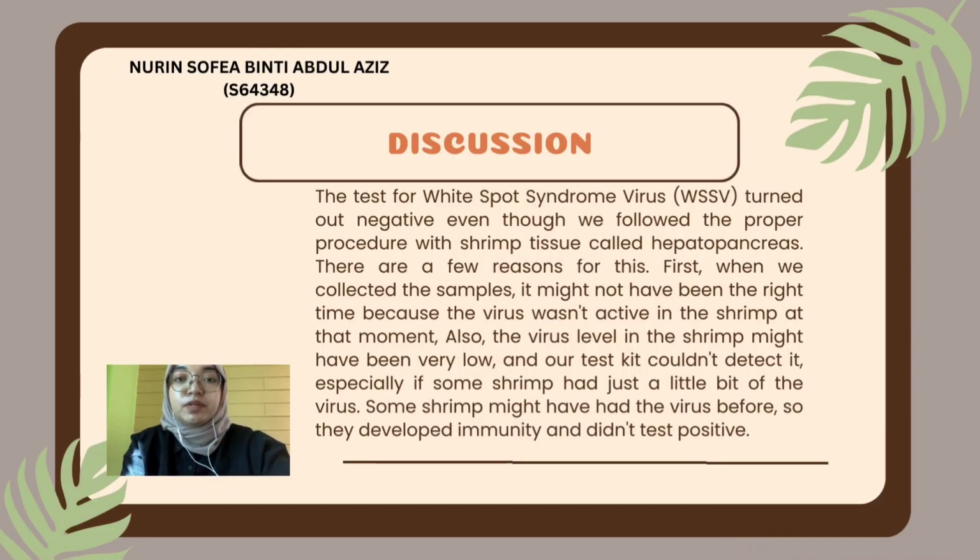Hi, my name is Binti Abdulaziz, S64348. So today we will discuss the results that we gained from the test kit that we did, which is white spot syndrome virus, and it turned out to be negative. Even though we followed all the procedures, there might be a few factors that led to the negative result. The first factor that might be the cause of our negative result is that it might not have been the right time when we collected the samples, which means that the virus was not active yet.